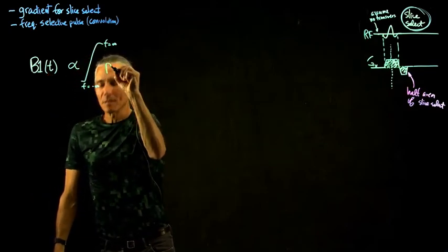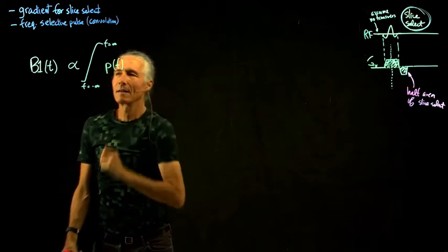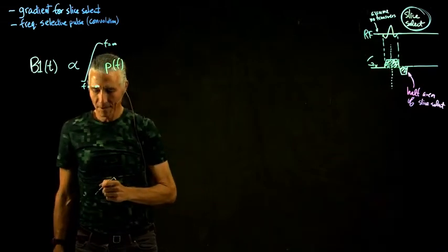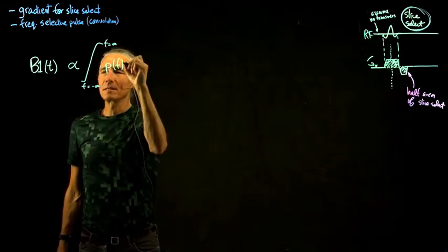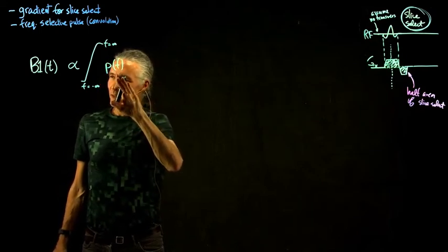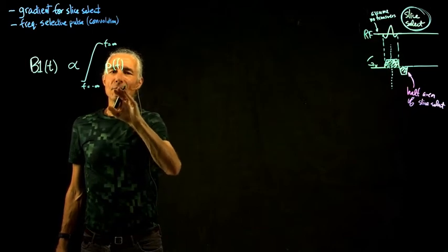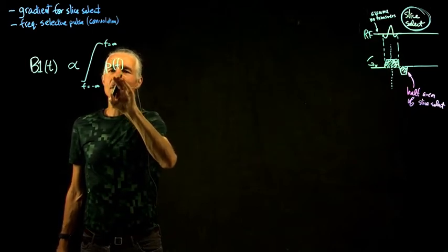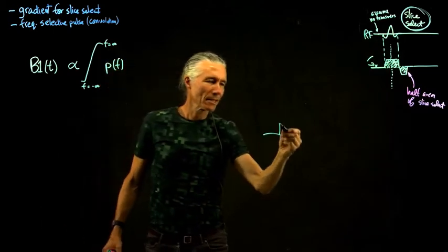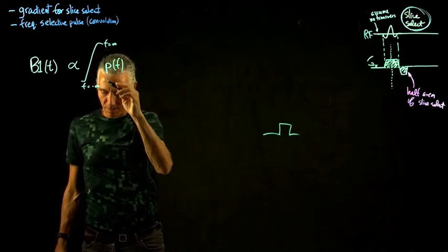And what we're summing here is however much we have at a particular frequency, and we're trying to solve for that, right? Because we want to actually know what our frequency, or actually we're trying to specify that because it's going to be something that looks like this that we're going to put in for our distribution of frequencies.